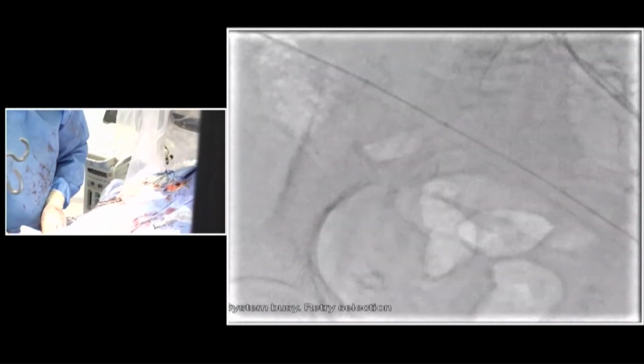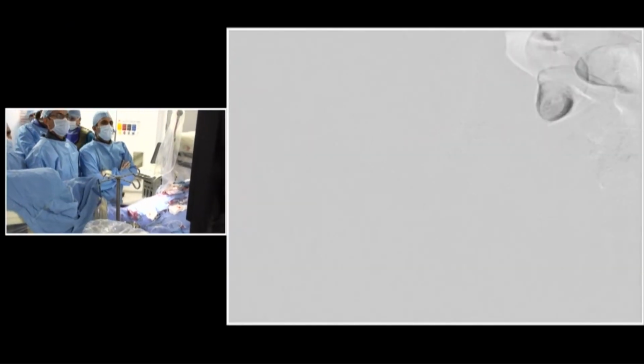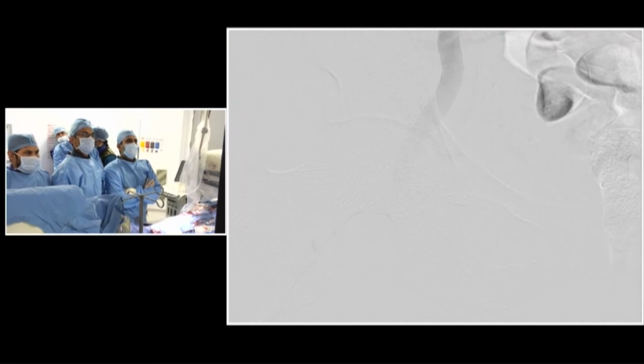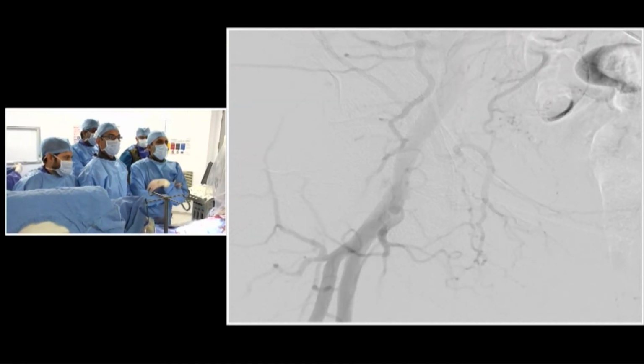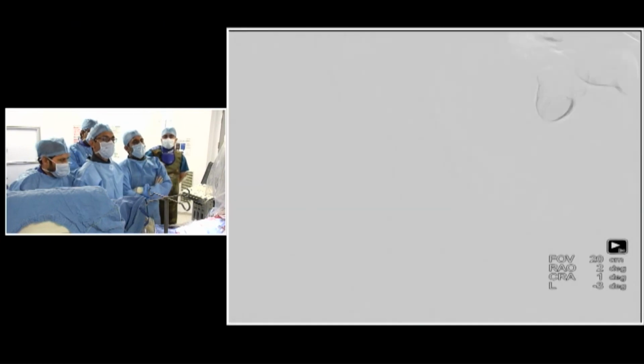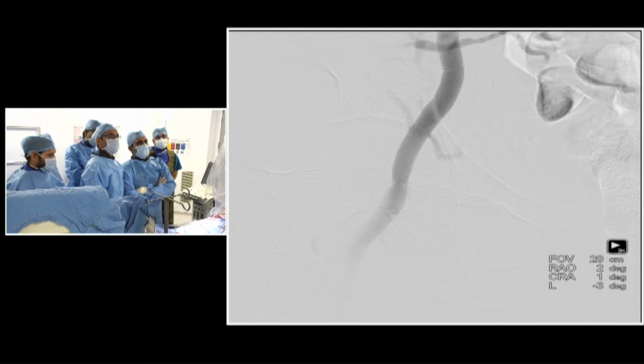What is your practice? You are using 2 or down? No, we're down to 1 now for the last about a year and a half. And then I think in about 50% of the cases, I find that we have to use an AngioSeal, but the other 50% looks just like this. Okay. I think with one device. So you can see the DSA with just one ProGlide. Yeah, perfect.